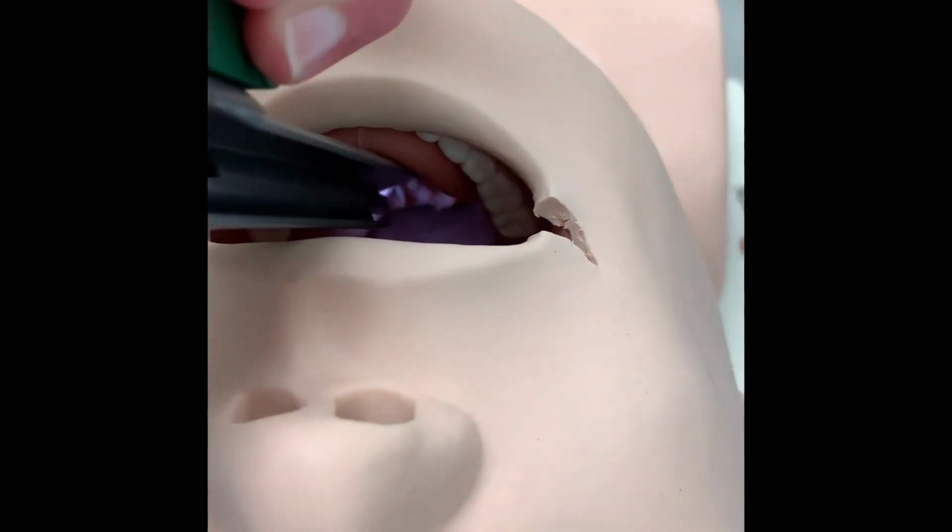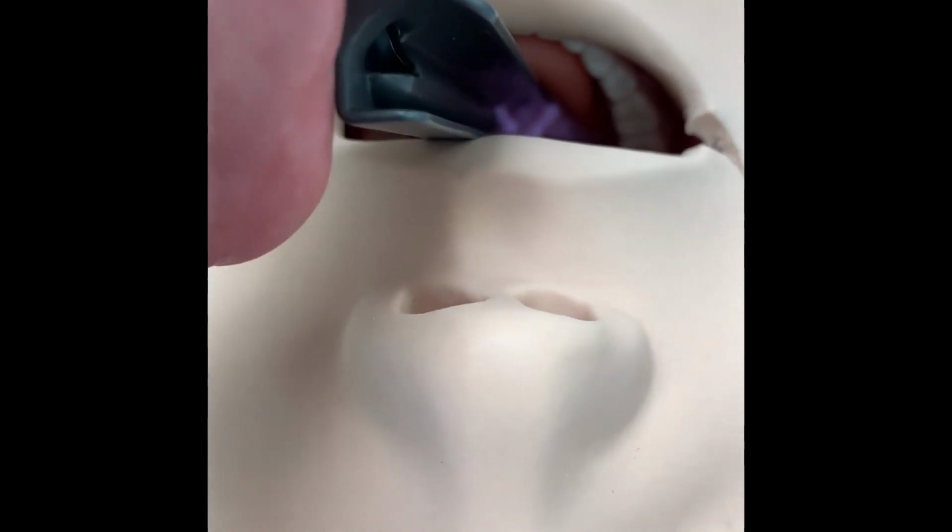And here's what the view would look like. So you'll notice there is no epiglottis in view because the Miller blade lifts the epiglottis.